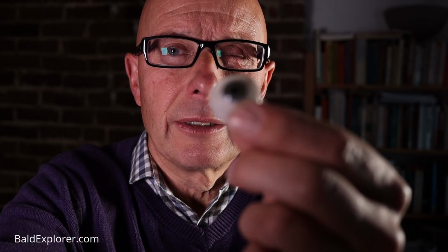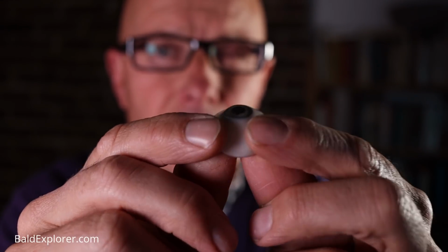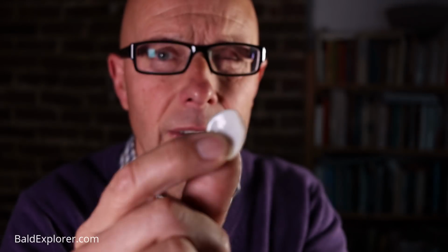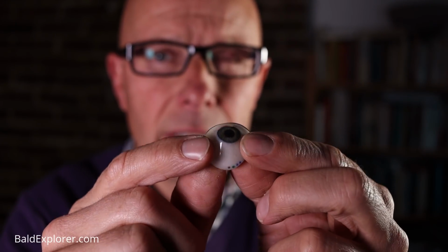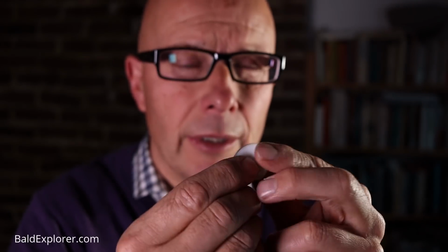Now I'm going to put my glasses back on so I can actually see what I'm doing. But I no longer have an eye in there. And that, I don't know if it'll focus on that. Let's just see if it will. This is the fake eye. Sorry, I'm just trying to keep it to focus on it. And it is just literally a little shell. Okay, so I can put that back in again. So that's what I look like without the eye in there.